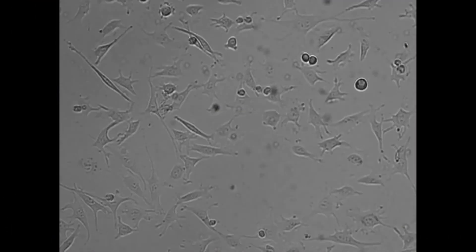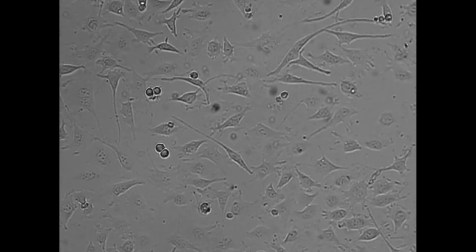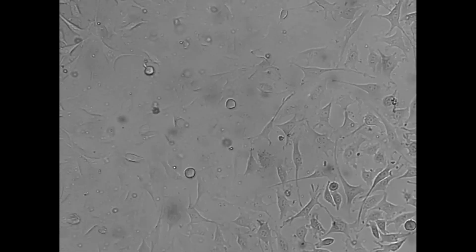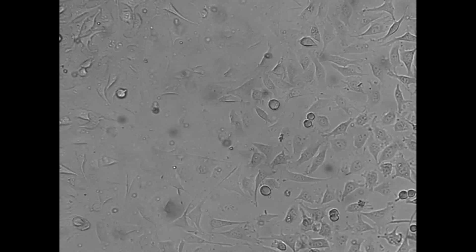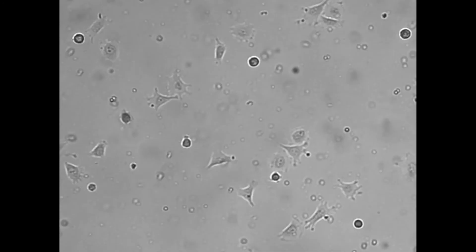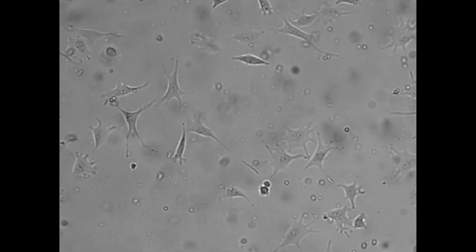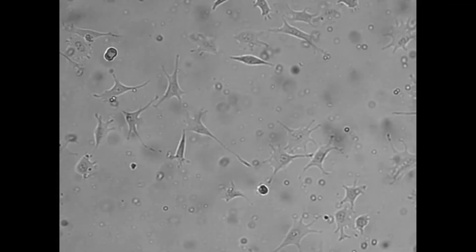The growth, adhesion, and morphology of the fibroblasts were the same on all three gels with different stiffnesses, suggesting that the cells did not sense far into the gel surface, but stayed within the three-dimensional coating. This coating remained stable for 72 hours.